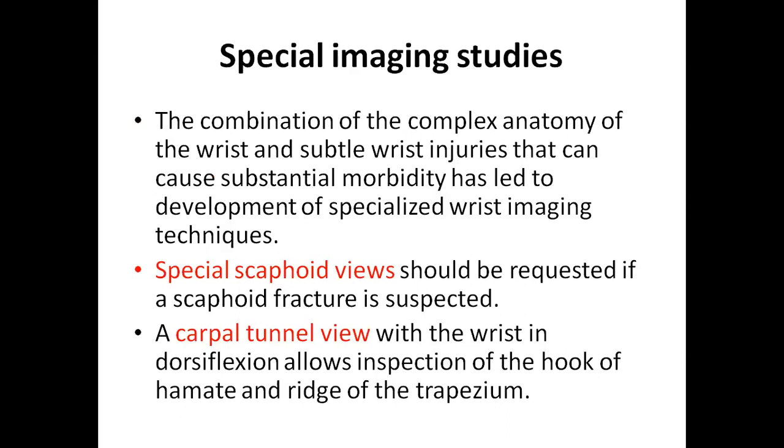There are some special views which can be used for different pathologies, specifically the carpal tunnel view or the scaphoid views.